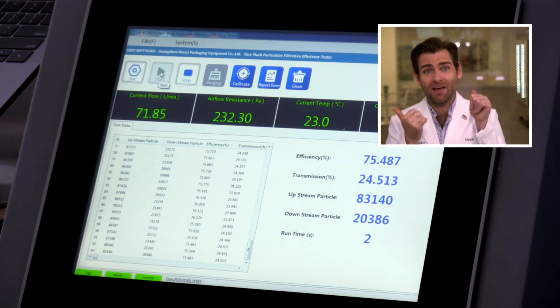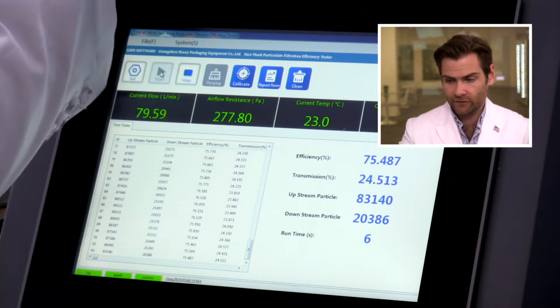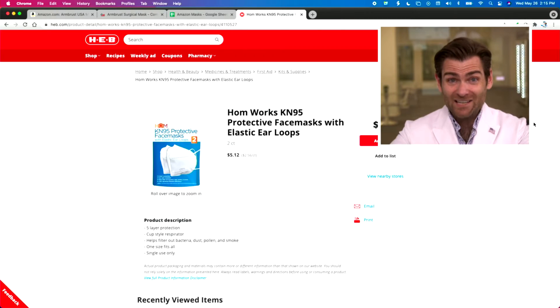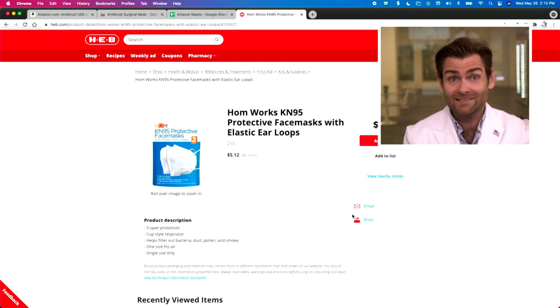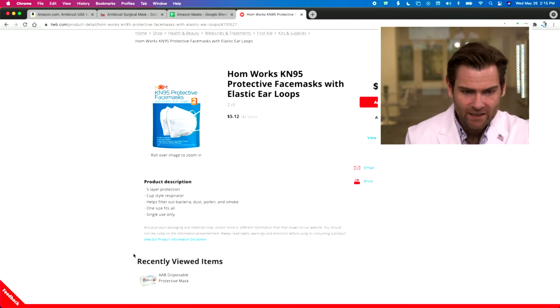Let's let it rip, HOM, let's see how you do. This is a PFE machine — particulate filtration efficiency. If you want to find out more, check out the link. H-E-B has had two masks during the whole pandemic, which is kind of crazy, and I think they bought way too many of these because these are the only ones you can find at my local H-E-B in Austin, Texas.